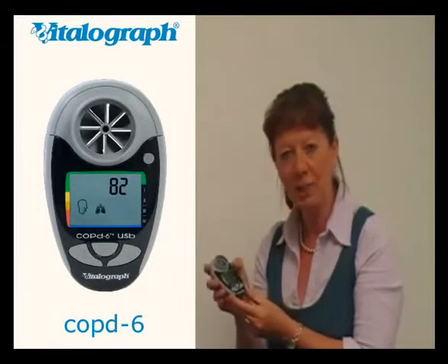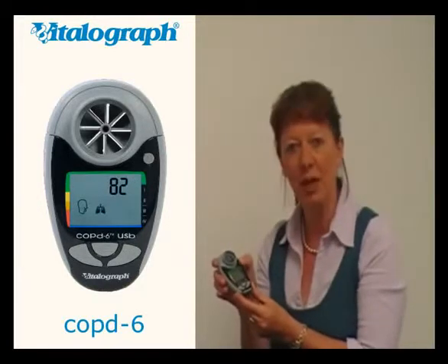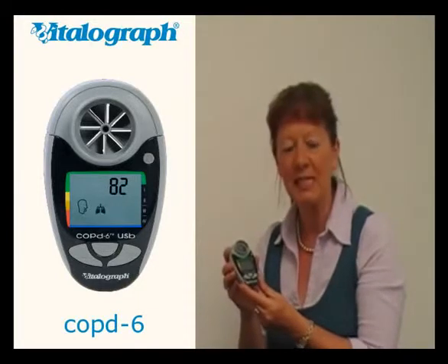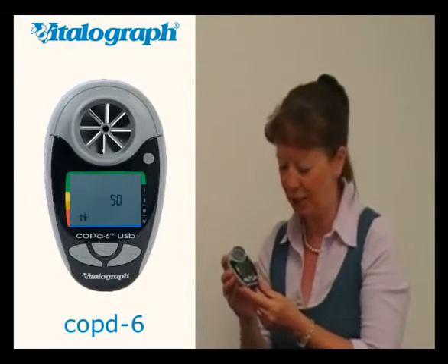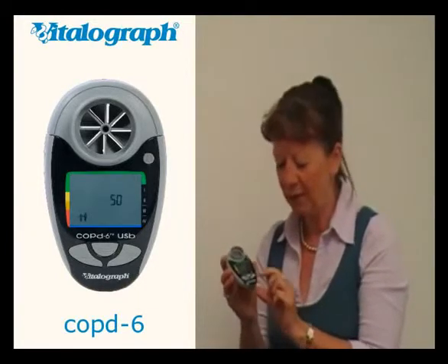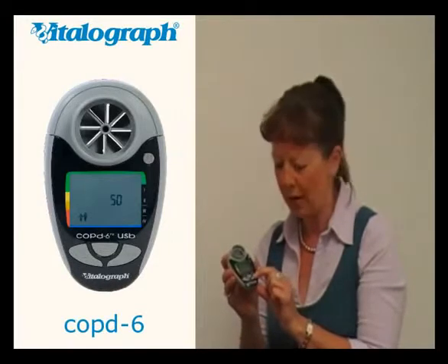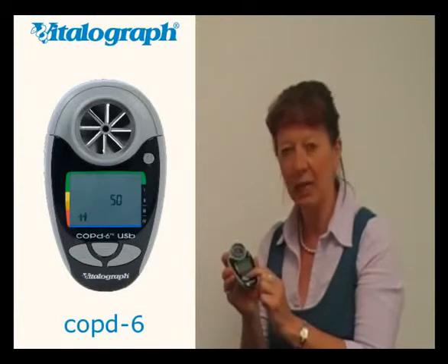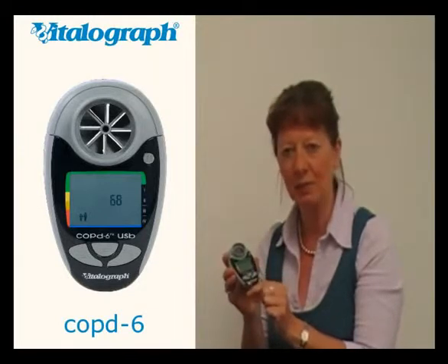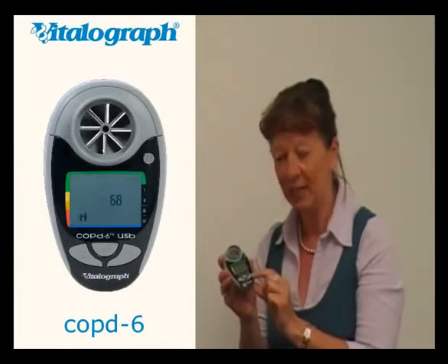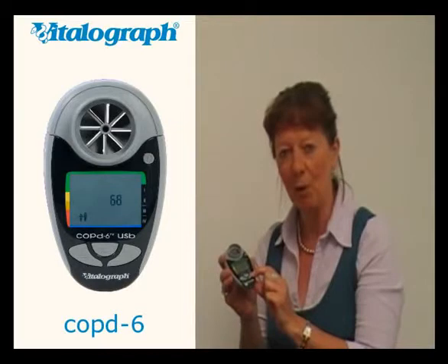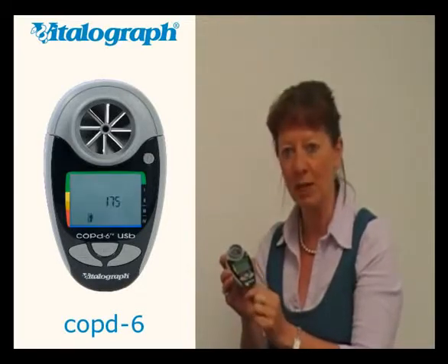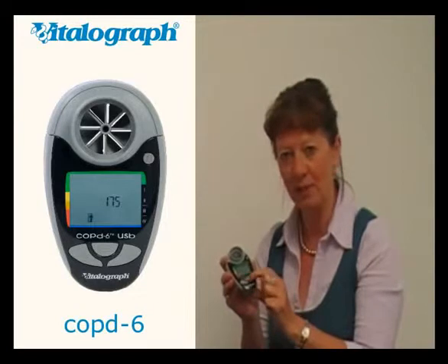Simply turn the device on using the circular button. This gives the facility to enter the subject age. Select the up or down arrows until the correct age appears and press the enter button. Again, select up or down to give the correct height of your subject and press the enter button.